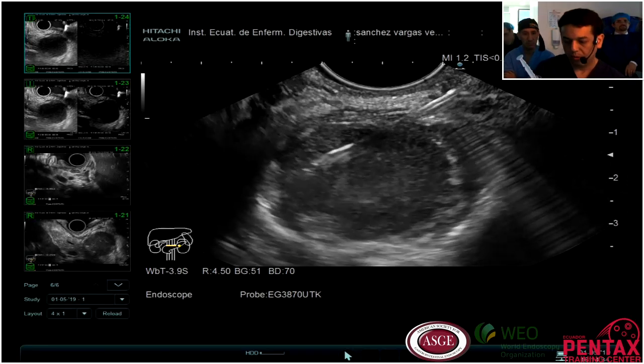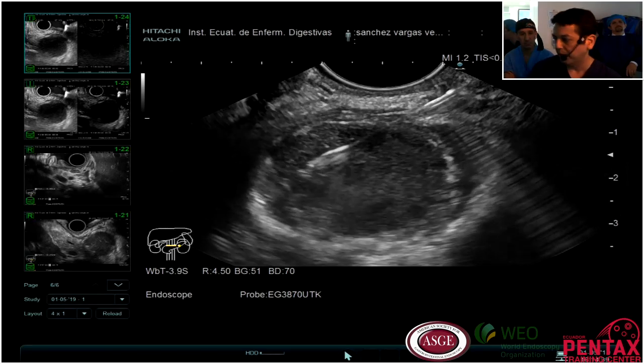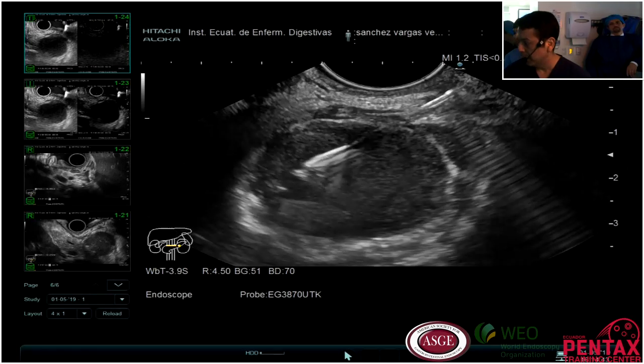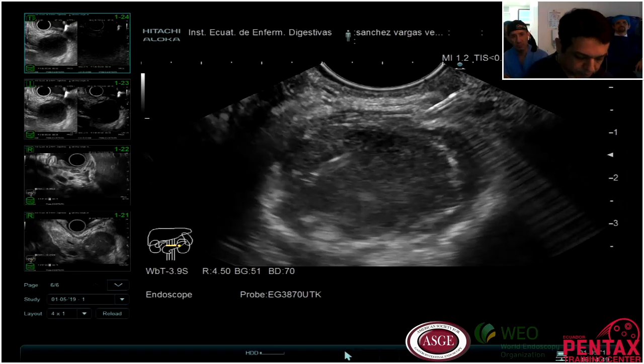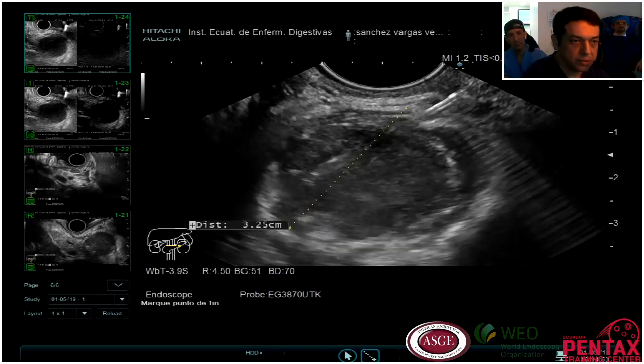For the liquid evaluation. So what I will do now, because this is a very small lesion, it is 3 centimeters, but she has abdominal pain.